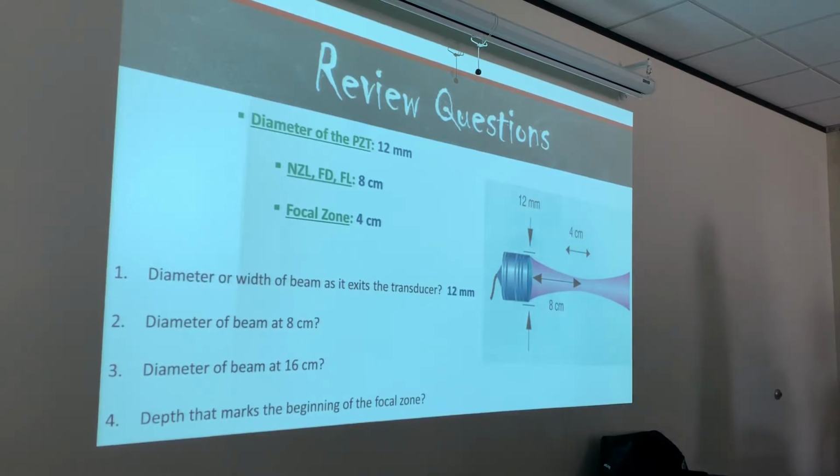We don't have a consensus? 6 millimeters. Guys, it's going to be 6 millimeters, because it's going to be half the transducer diameter. Okay? Make sure you use the correct units.